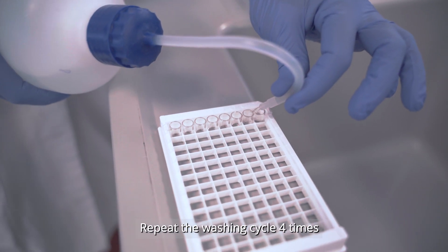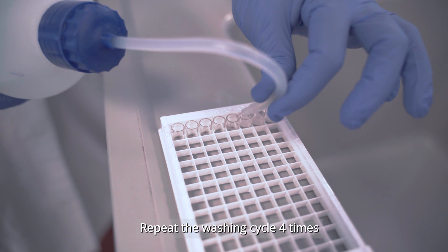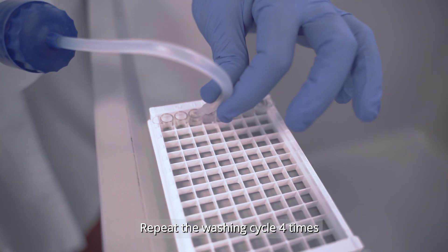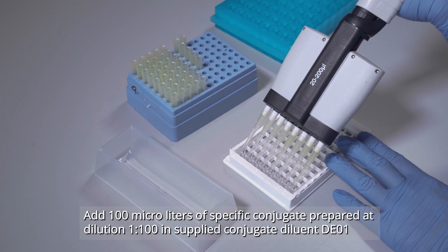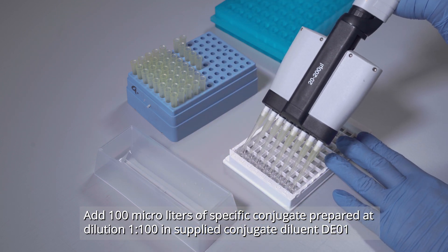Empty the wells into a container with sodium hydroxide solution and wash four times. Add 100 microliters of specific conjugate to each well.